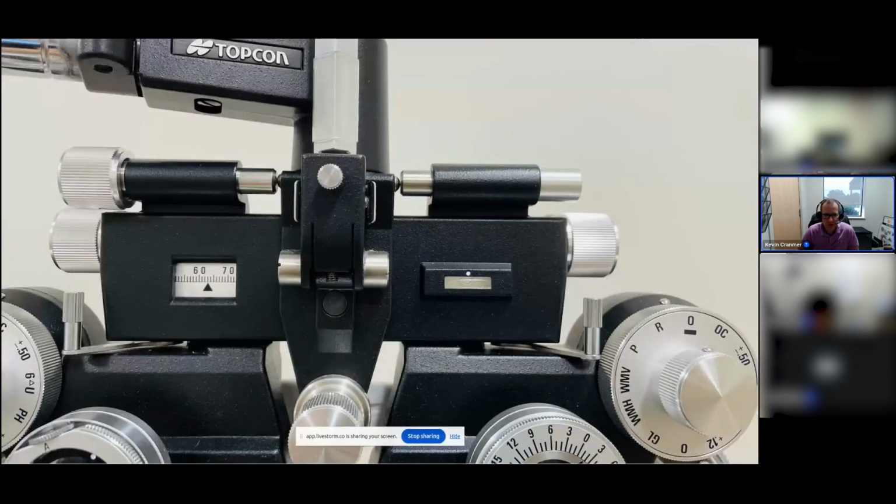So here's a picture of the top of the phoropter. This is a Topcon VT10, but pretty much all the phoropters these days look basically identical. At the top, there's the attachment to the arm that connects the phoropter to the stand.